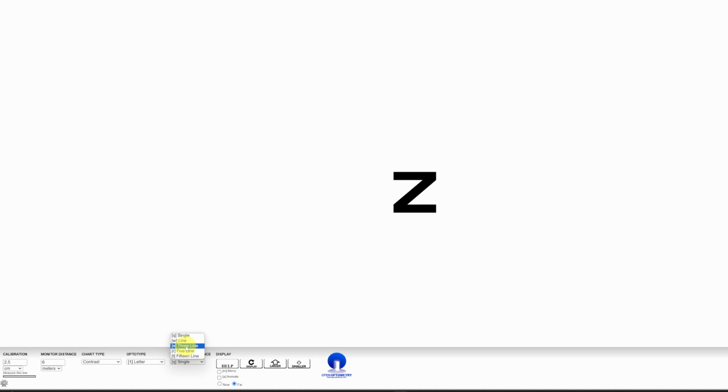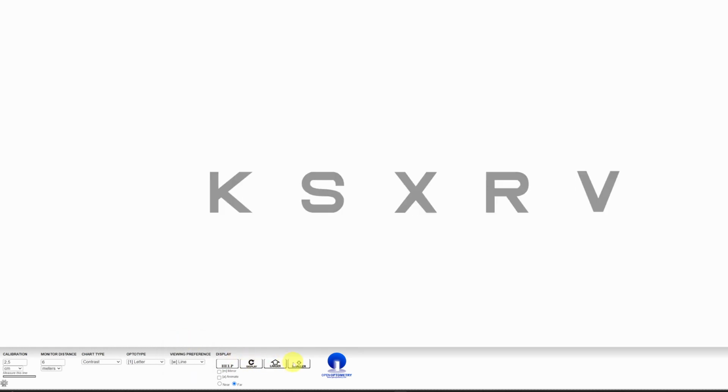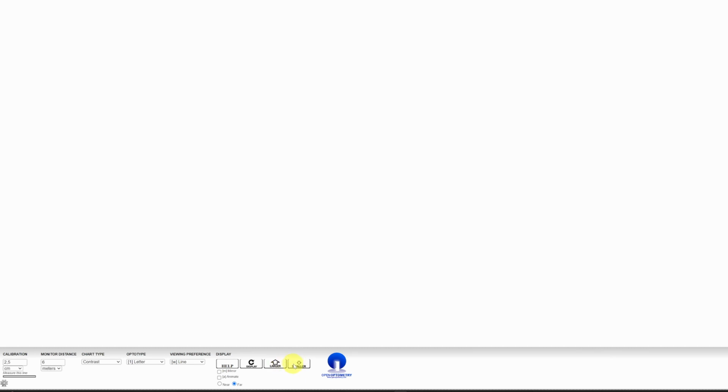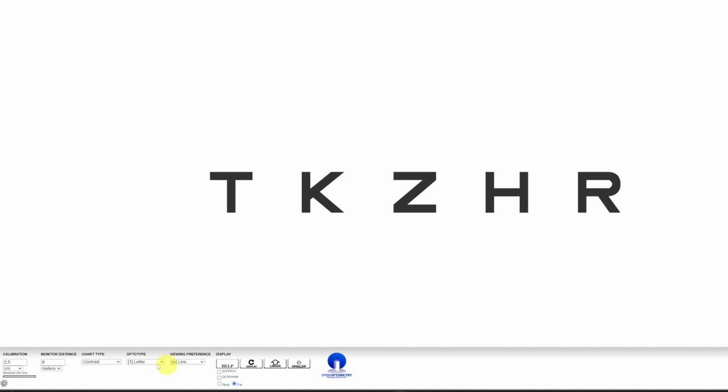You can make it a line, let's say, and as you get smaller lines, you'll see the contrast diminishes. So you can also test contrast. Let me go increase the contrast again. So there's a variety of factors. You can play around and see all the different optotypes and all the different features, and you can fiddle with this online at your computer.